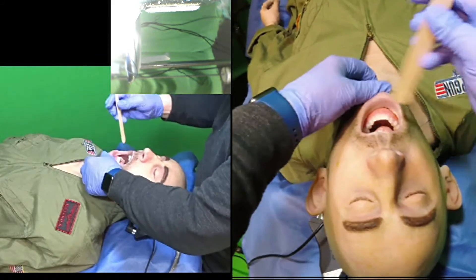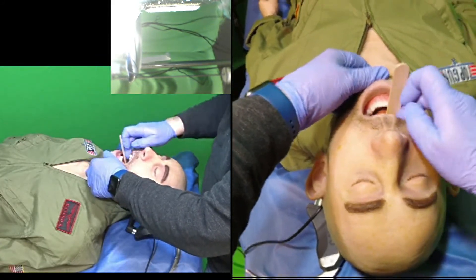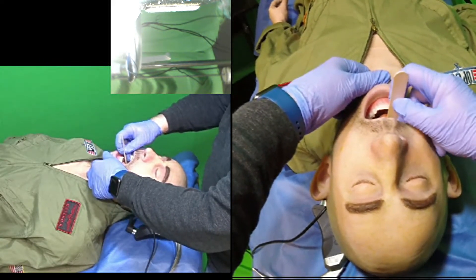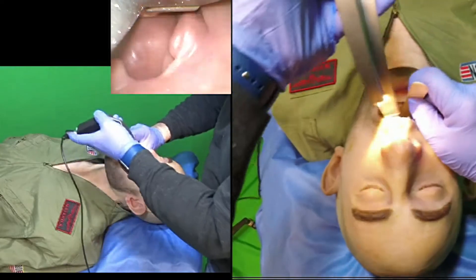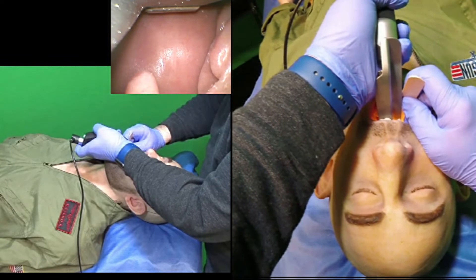I'll push the chin down on the mentum and place the tongue depressor as deep as I can. I'll use the middle finger instead of the forefinger against the teeth. I'm going to use my thumb and forefinger on the tongue depressor to push the tongue into the floor of the mouth and open the oropharynx maximally to place the laryngoscope blade on the first attempt.